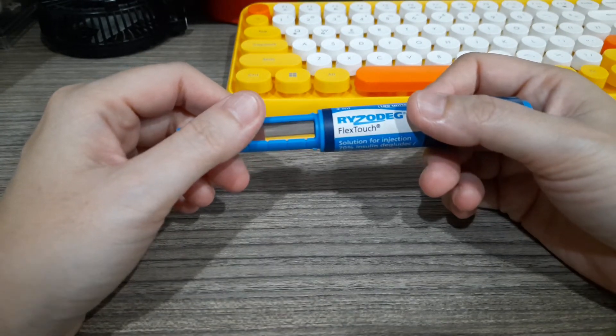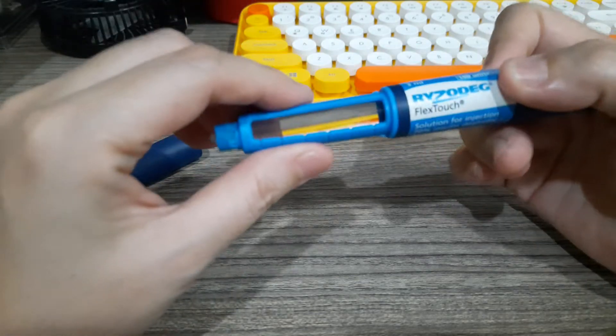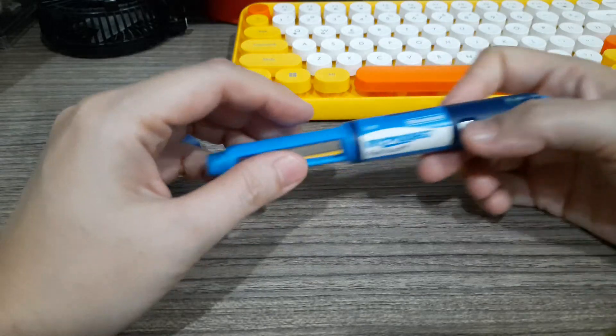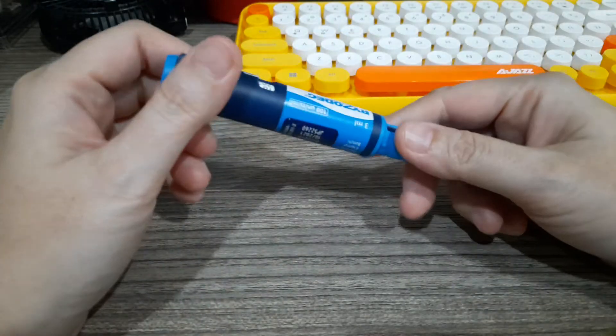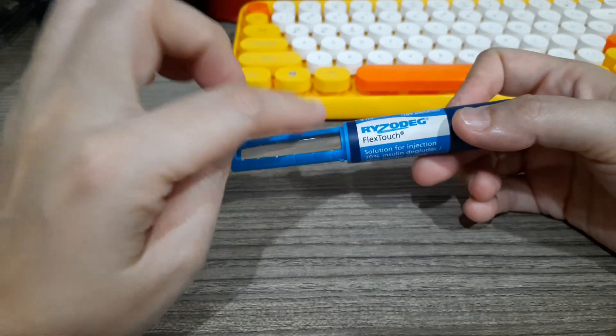The Ryzodeg pen is a combination of a fast-acting insulin and a long-acting insulin. It's specifically premixed so that you don't have to shake it or roll it like the NovoMix pen. The NovoMix pen is made by the same manufacturer, but with Ryzodeg you don't need those extra steps.